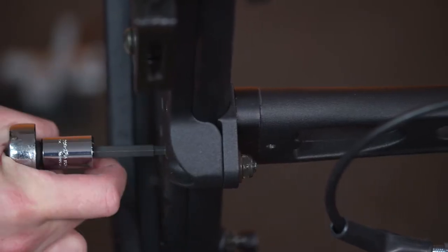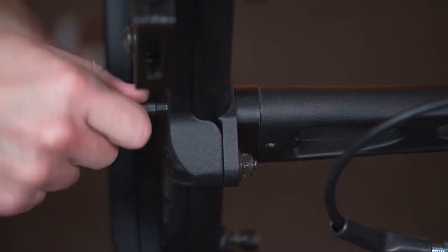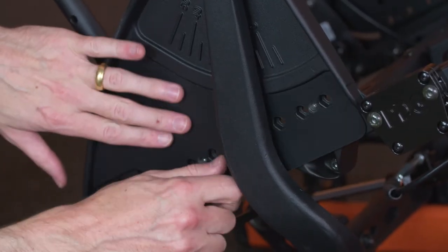Torque the fasteners to specification. Reinstall the cover plate.